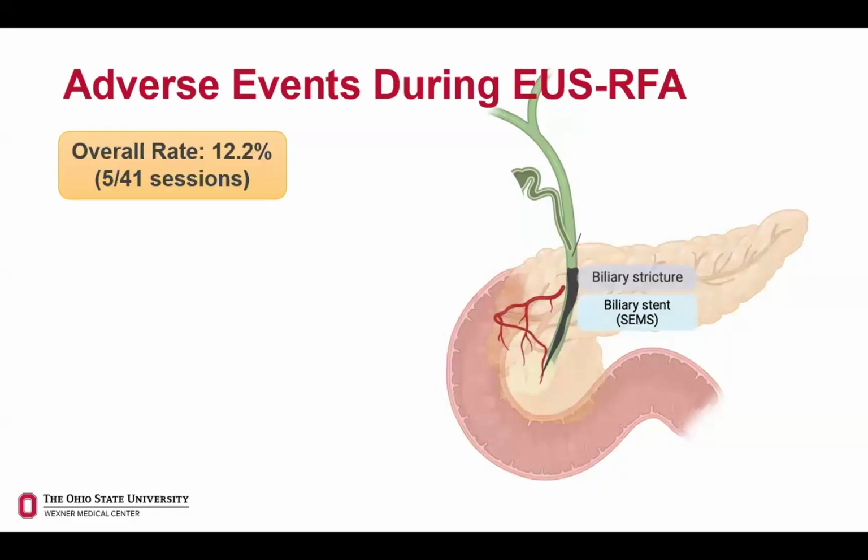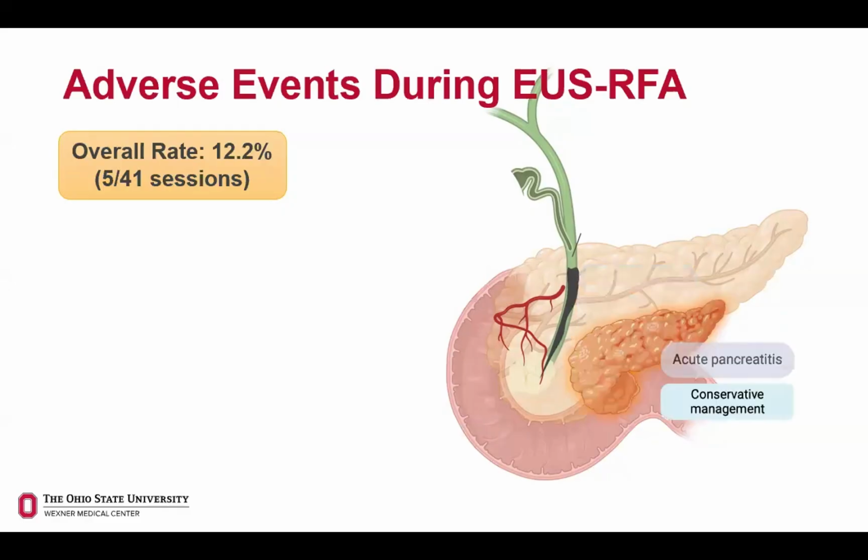Over 3 months, one patient developed a stricture and LFTs went up. We watched it, and eventually we stented even before the patient turned jaundiced or got any infection. We were able to successfully dilate with a covered metal stent. This is because when you start doing RFA of large IPMNs in a 3-dimensional plane, you don't know what structure is close: bile duct, pancreatic duct, or a blood vessel. A couple of patients, including the patient I described earlier, had 2 episodes of pancreatitis, both managed conservatively.